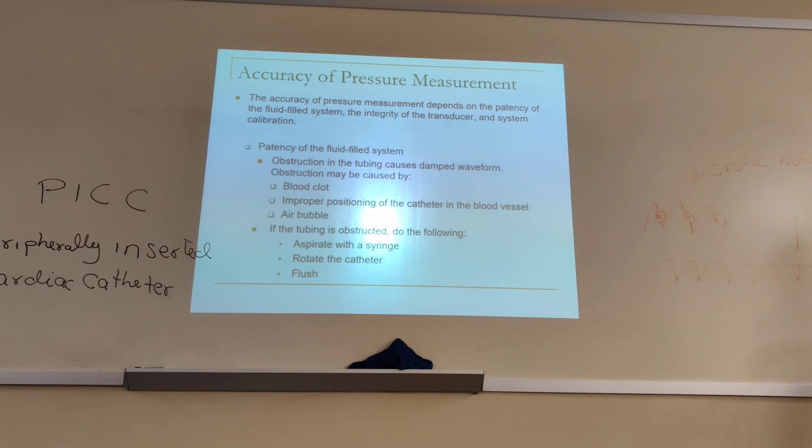Now, I don't see the dicrotic notch here. That's a damped waveform. It's an abnormal waveform. Therefore, I should not trust the blood pressure that comes with it. Anytime you have an abnormal waveform, you should not trust the blood pressure that comes with it.